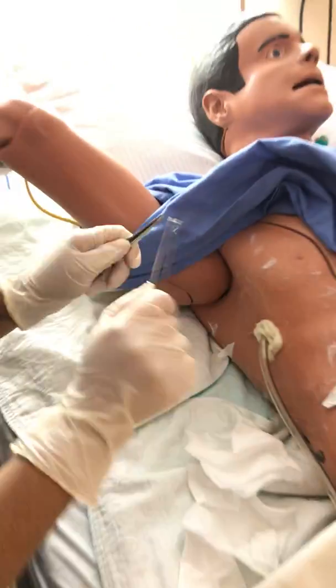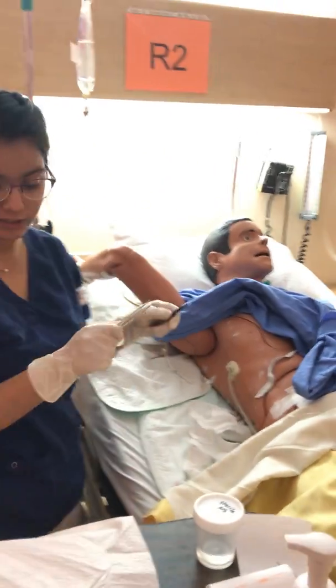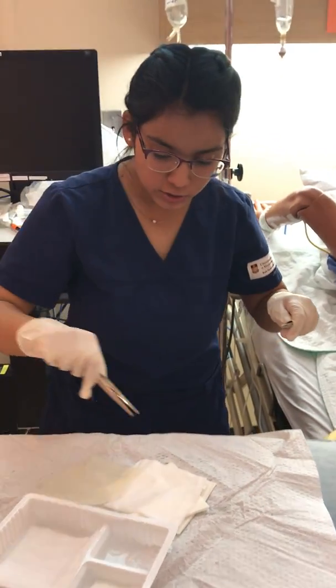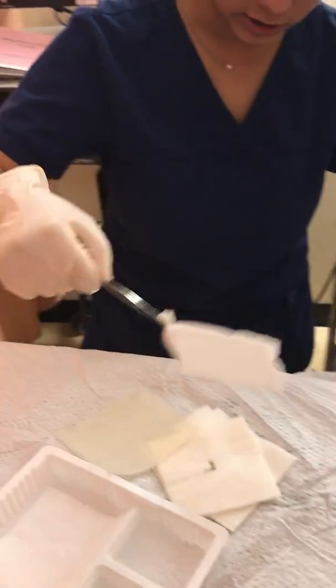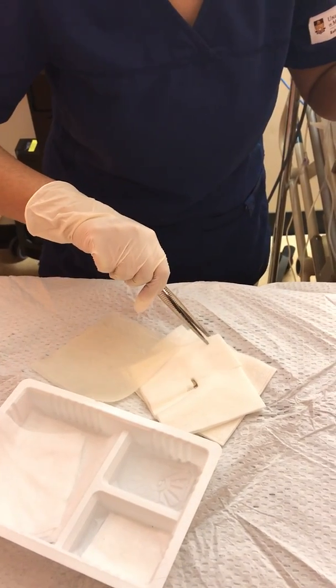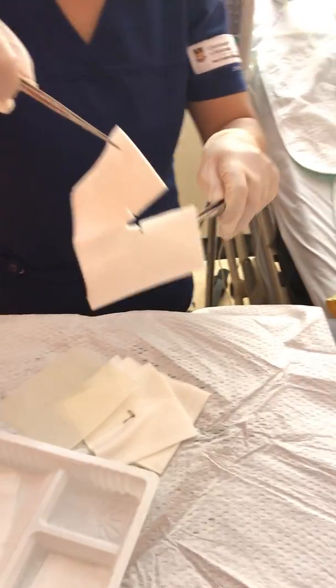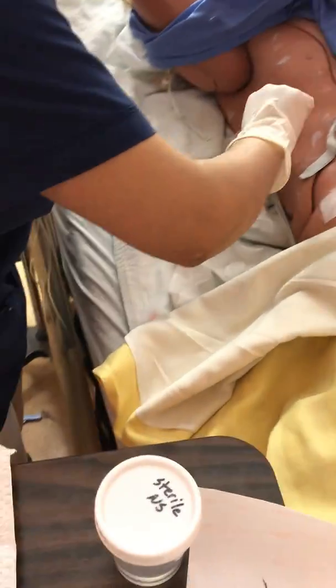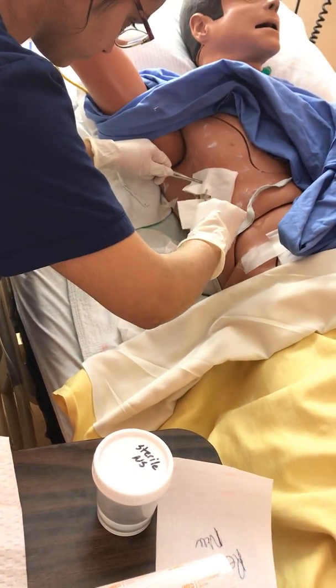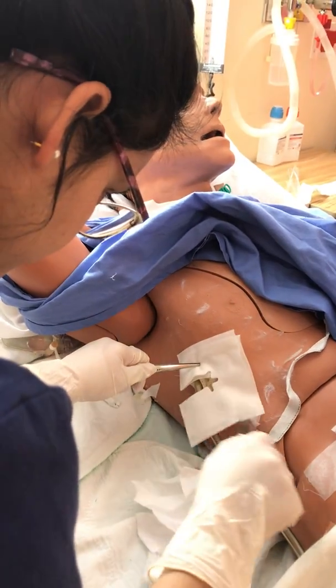So now that I know that it's fully occlusive, there's no air that can get in, and I'm also aware of how I'm holding my forceps. So now I'm just going to take my drainage gauze. So I have my 50 ml normal saline, and my drug is not expired, so I'm good. So we're going to put one in this. Blood spill. Making sure I didn't touch the tip.